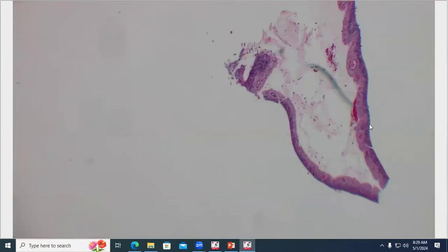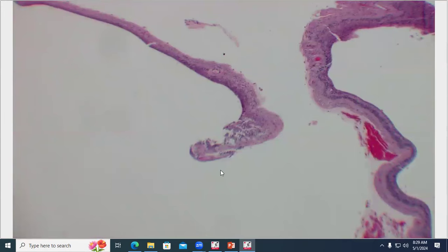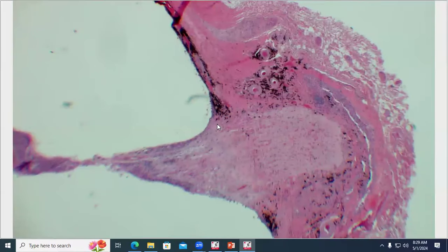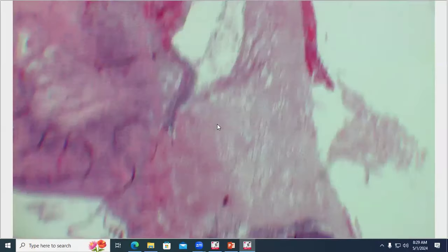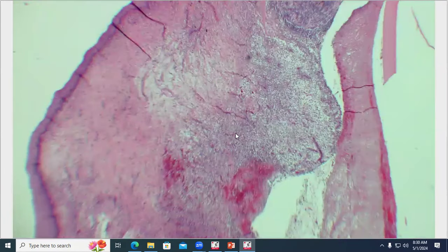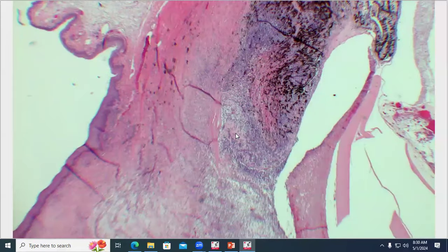And then if we keep going back, our retina here is diffusely detached and is torn. Got nice rounded edges here to the retina. And then we can't really say much about the optic nerve head because it's a little bit distorted from the detachment, but the optic nerve looks okay. Got a pretty rocking inflammation and stuff associated with the descemetocele that probably ruptured at this point. Not really sure what led to the initial insult of the corneal disease. Sometimes we can find the surgery site, but that wasn't really attainable with all the other changes going on here.